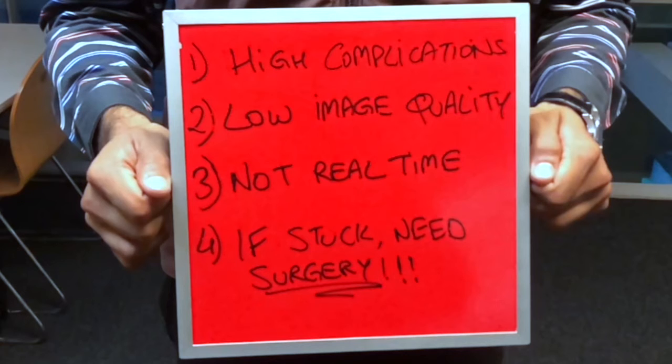Moreover, if you have a tumor in the small intestine, then there are more chances of the capsule getting stuck at the tumor. Even in some cases, the capsule gets stuck in the small intestine, so we need to perform a surgery to get it out of our body.